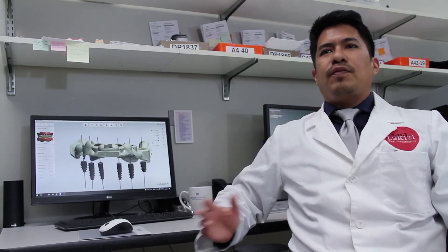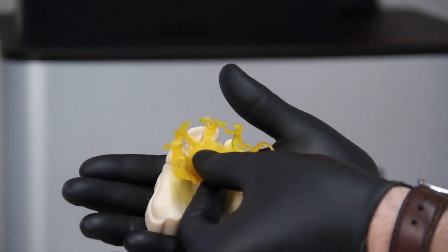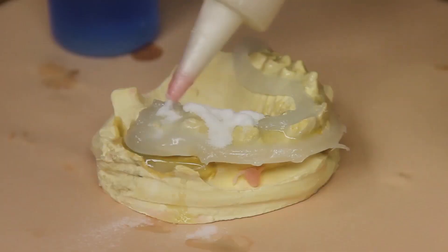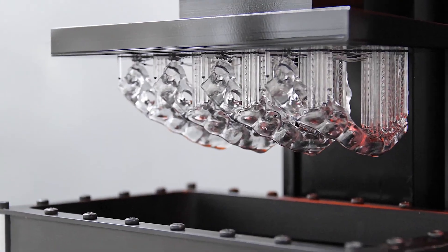I always give five stars to Envision Tech. Whatever I print is always accurate and very strong. The machine makes me better and helps control the time frame. I don't want to wait 2-3 days for a model — I want it the same day.